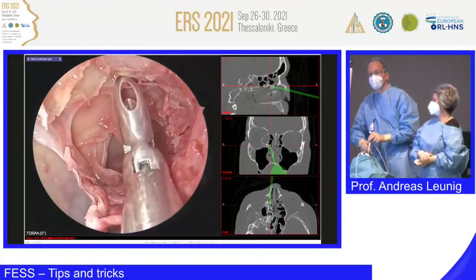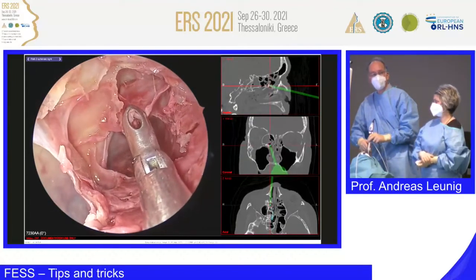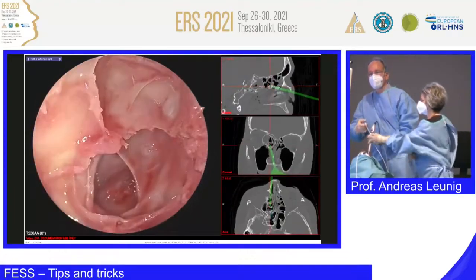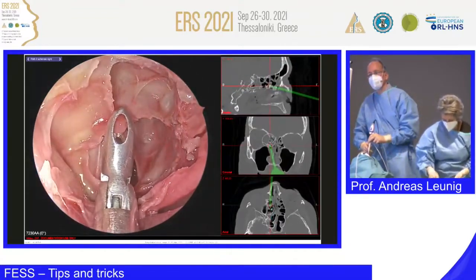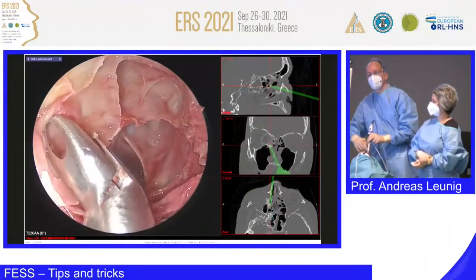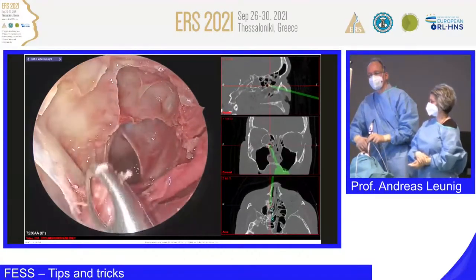Good? Okay. So usually I don't do it, okay? Usually not. It's just to demonstrate, not more. Okay, to get a little bit more information about the anatomy by using the endoscope. Now, I take out this. I love the mucosa. Mucosa is my best friend.